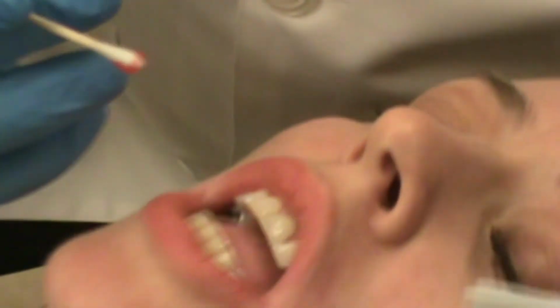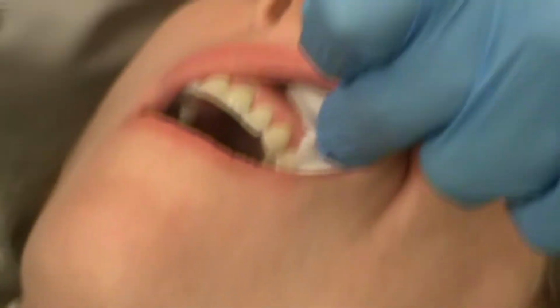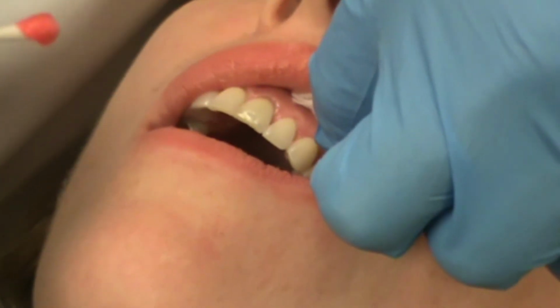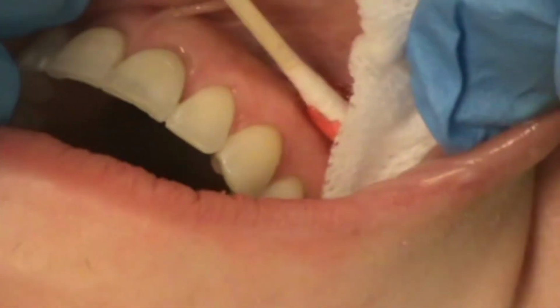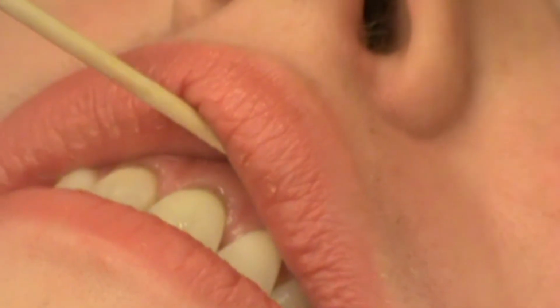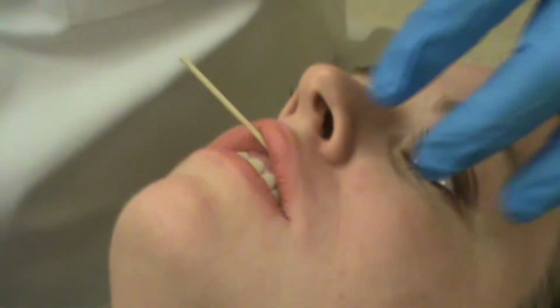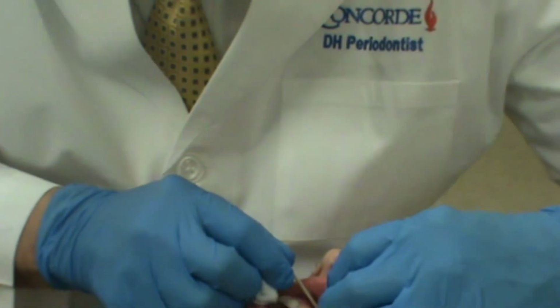Now, topical anesthetic does not penetrate well when the tissue's wet. So you take gauze. Some people actually advocate drying it with a little air. And once the tissue's dry, you see that tissue's dry, then we place the topical like that. And ideally, you let it soak in for a minimum of 1 minute for it to be effective. It will continue to be even more effective if you go over 2 minutes. And that will allow you to sneak that injection in, and in a fairly painless manner.